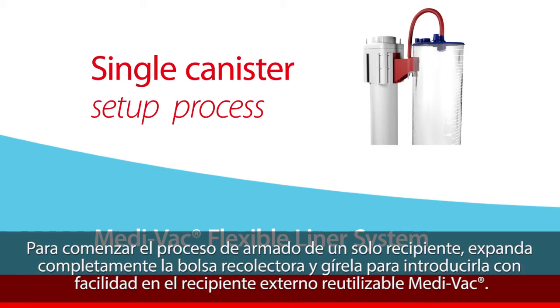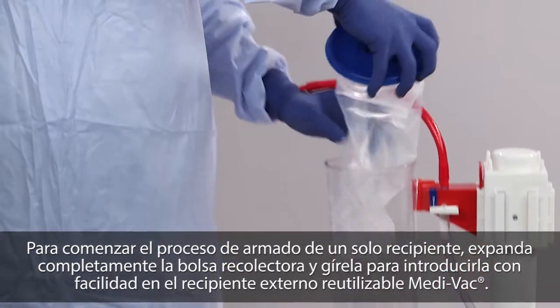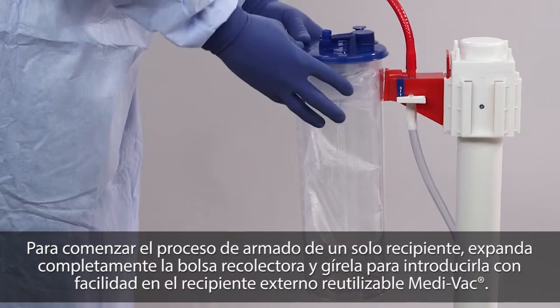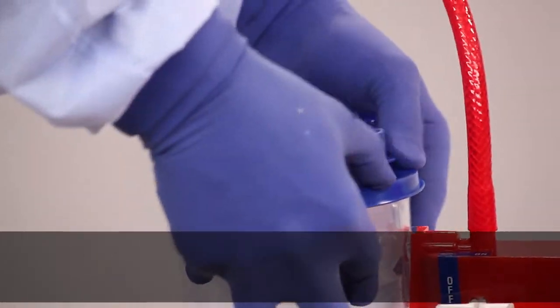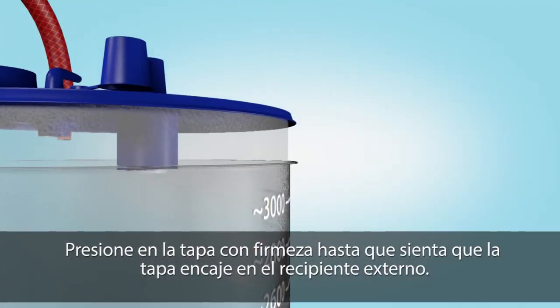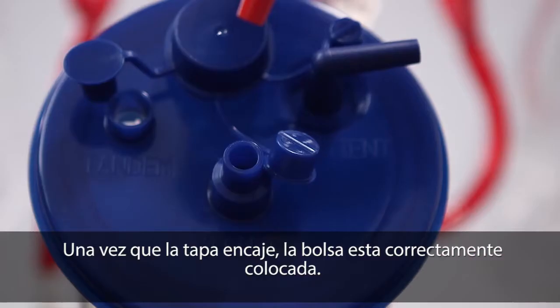To begin the single canister setup process, fully extend and twist the flexible liner to enable easy insertion into the corresponding Medivac reusable outer canister. Ensure sizes are the same. Press down firmly on the lid until you feel the lid tabs engage the outer canister. Once tabs are engaged, the liner is properly sealed.